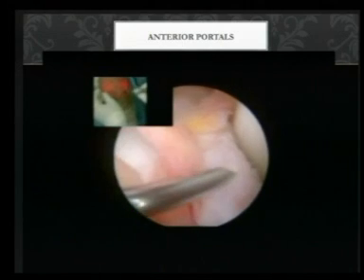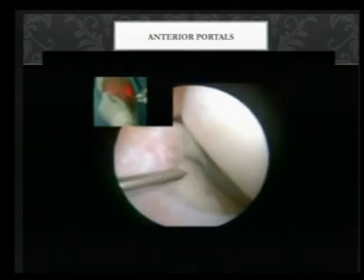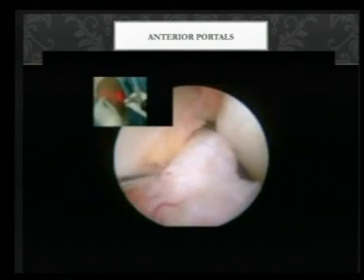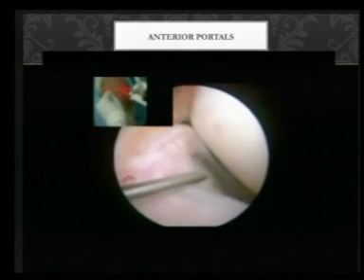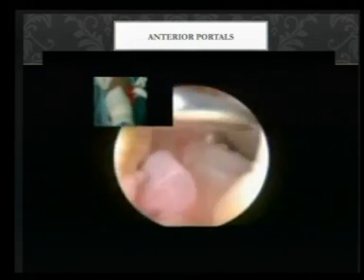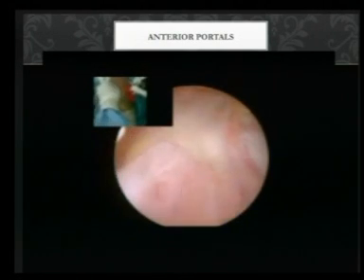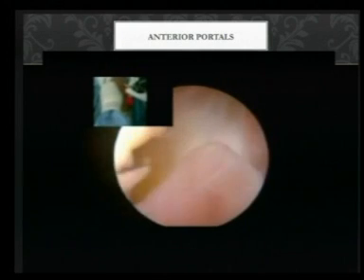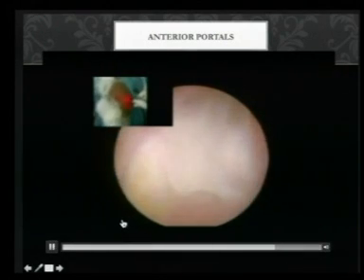This has to be established in such a way that you're above the medial meniscus. Also, you're not too close to the femoral condyle. If you are too close to the femoral condyle, when you make the drill hole for the femur, you can be excoriating the articular cartilage. The next slide.